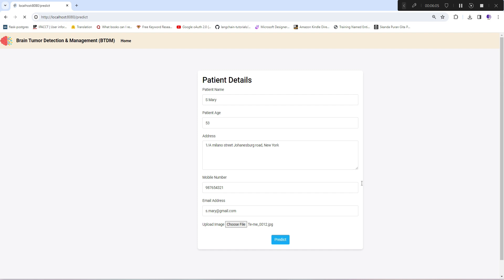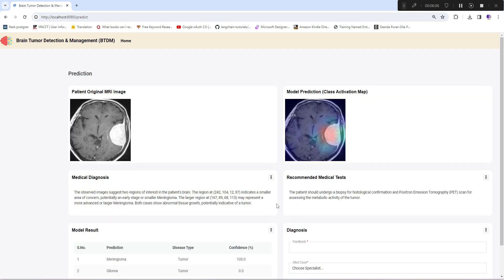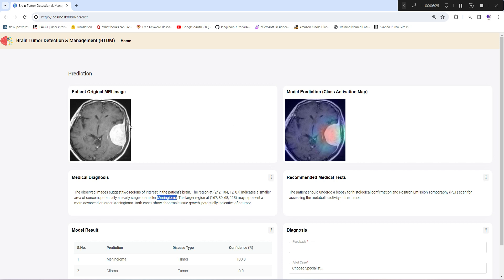The computer vision model along with generative AI model will run in the backend. As you can see, the model has predicted correctly - meningioma. The heat map is also pointing in the right region; the concentration is on the affected region.